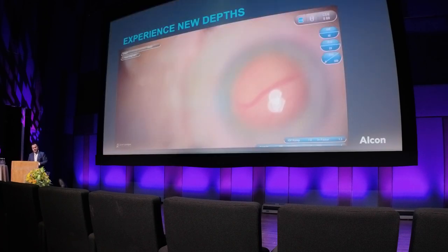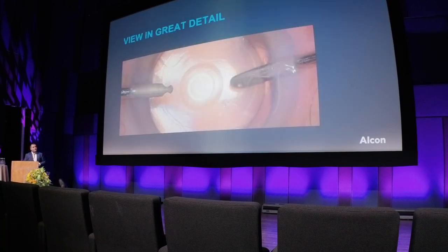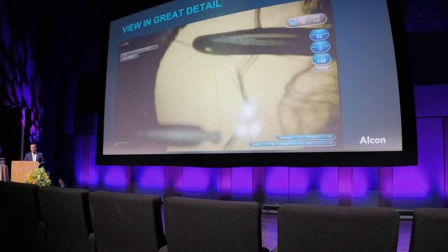Here is an example of how you can see the fundus and vessels through the Ingenuity without any biome, contact lens, or any additional optic. If you apply a filter, it can increase the visibility of certain structures such as vessels. Here you can appreciate the level of magnification and the structures that you can see.